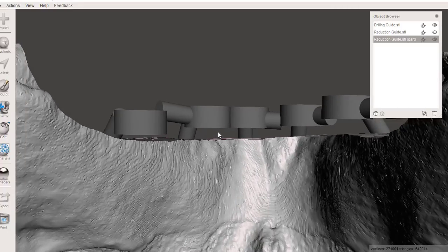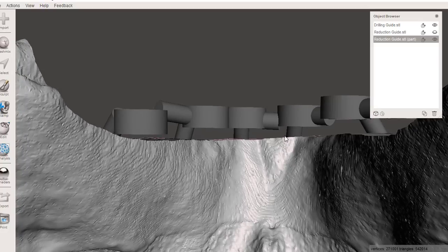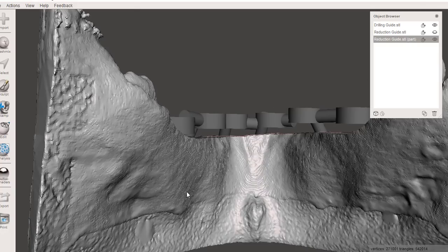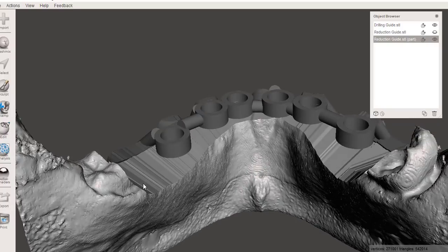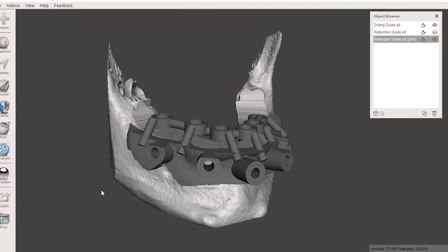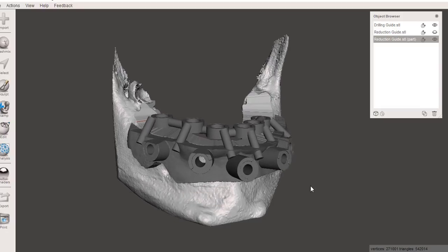Everything's indexing on the buccal, and so if you leave a little piece of bone high, as long as it's not crazy excessive, it's not going to matter because the guide tubes are floating up and off the ridge. If you would like, you can always carry this around to the lingual. That's certainly an option as well. But this is a nice option, and I hope this was helpful to you.